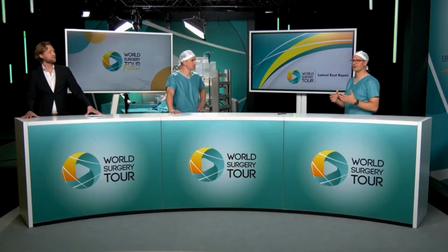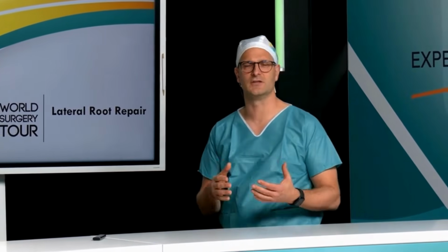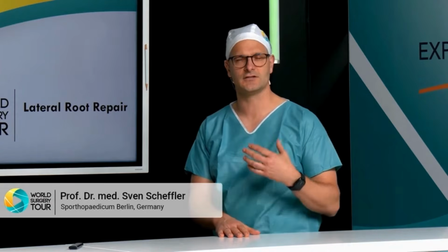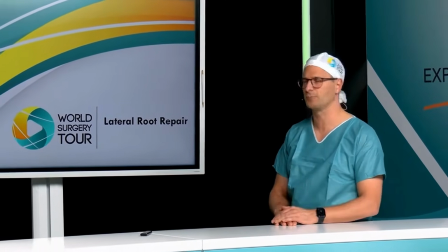So whenever we talk about ACL injuries, we are aware that there are several types of meniscus injuries. And the one that we know in terms of stability seems to be very relevant is the root tear. And classically, the ACL injury occurs combined with the root tear of the lateral meniscus. And that's actually what we're trying to demonstrate. Number one, how to restore the fixations or the footprint of the posterior root.